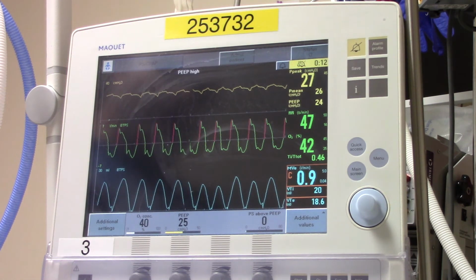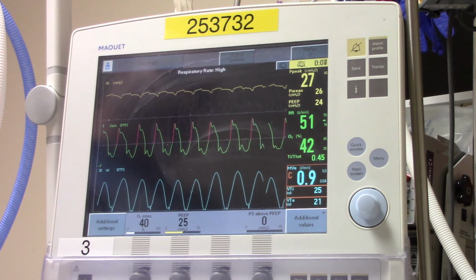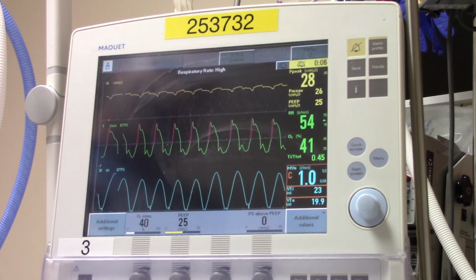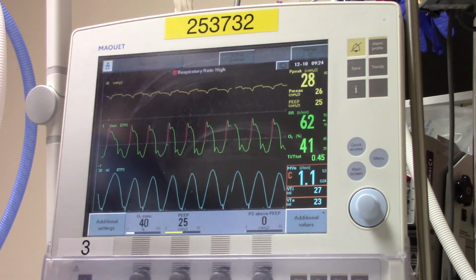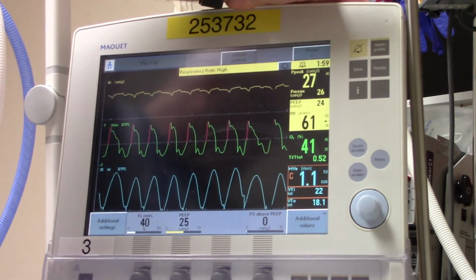Now we still have the same amount of peak pressure, if you will, in the chest during the inspiratory hold phase. However, the patient is able to move flow and move volume in and out during the inspiratory hold phase that you're attempting to perform.